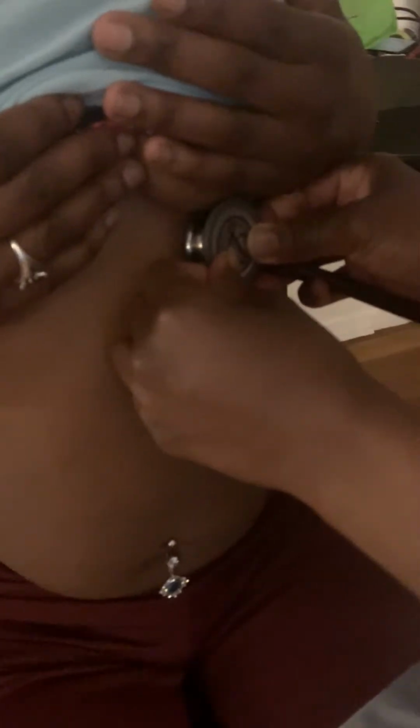Good. And then I will go down to the fifth intercostal space and listen to the tricuspid. Very strong and good. All right, and I will go over to the left sternum bottom, mid clavicular line, fifth intercostal space, and listen to the mitral valve.